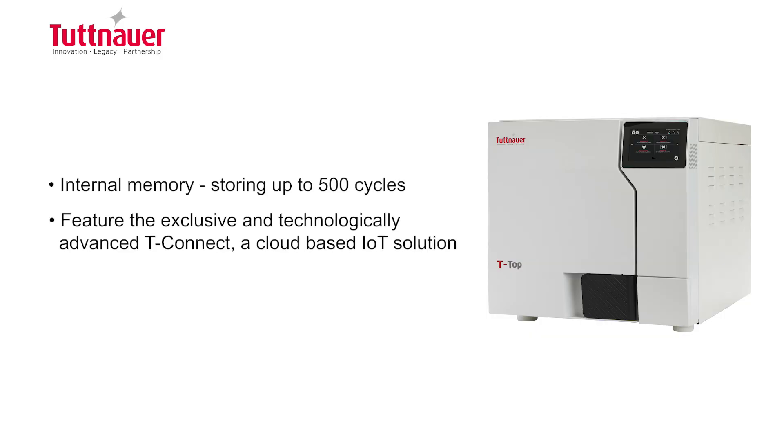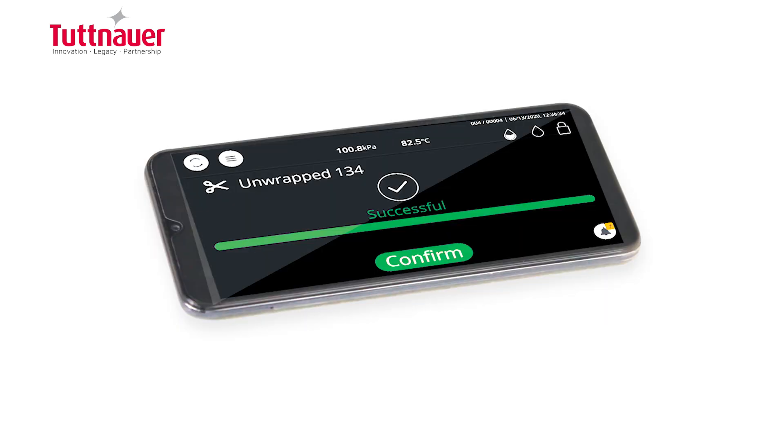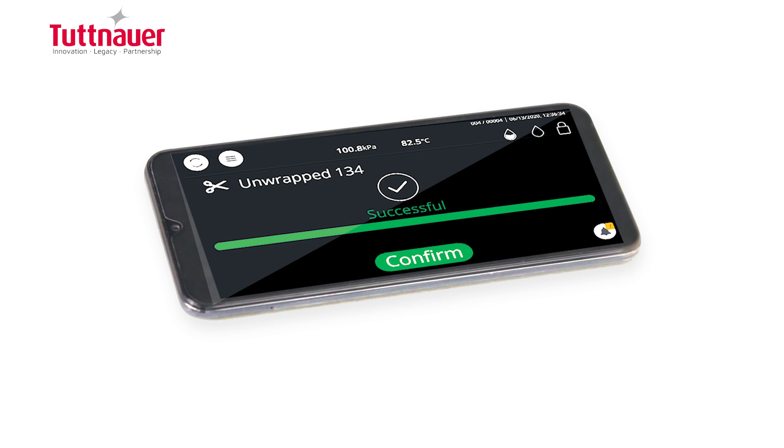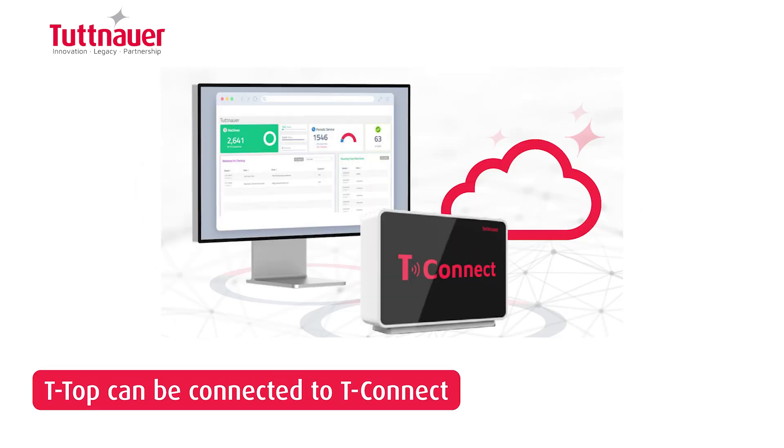Sterilization cycle data is automatically saved in the internal memory of the device and on the cloud. The T-Top can be easily connected to your mobile phone, allowing you to monitor the sterilizer in real time and get notifications when a cycle is complete. It can also be connected to T-Connect and to an external printer to improve workflow efficiency and results.